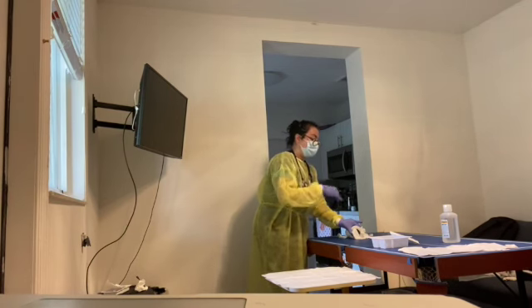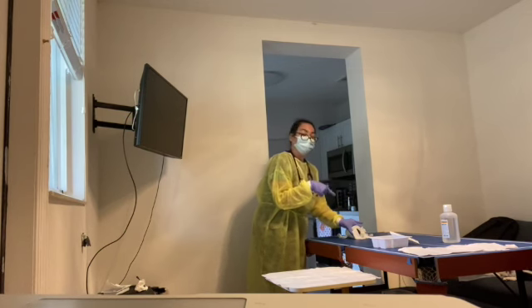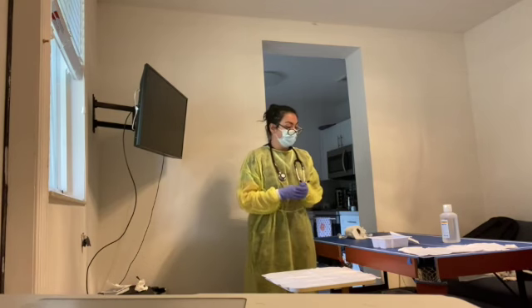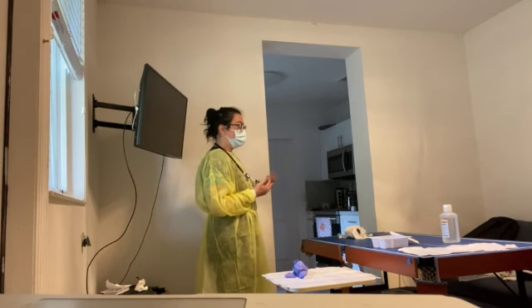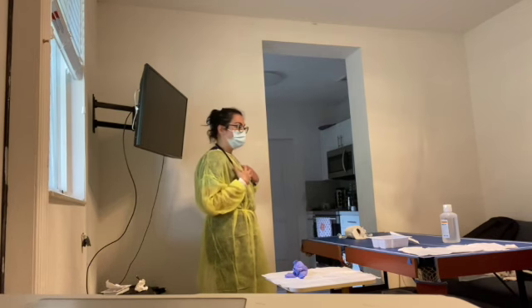And once I make sure that the new string is in place, I will remove the old string and dispose of all my materials. I will take my sterile gloves off. I will make sure that the patient is in no type of discomfort or pain, and there's no bleeding or any type of purulent drainage.